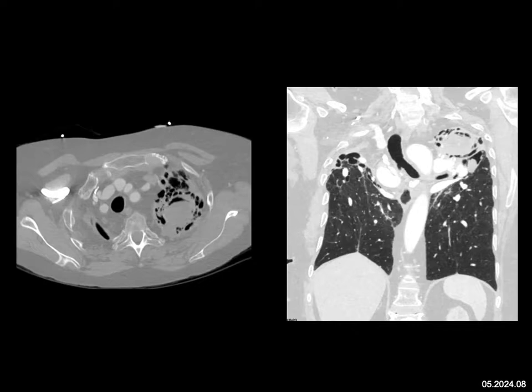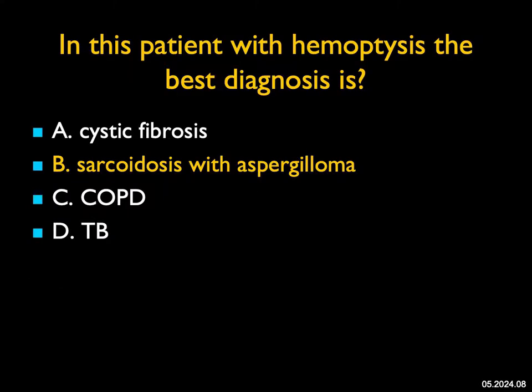Because the rest of the lung fields look good, this is not cystic fibrosis and it's not COPD. It's unlikely to be TB, though TB can have many forms. This is more classic: elevation of the vessels, elevation of the bronchi, cavitary lesion with aspergilloma. Sarcoidosis is a great possibility — and that was the correct answer.